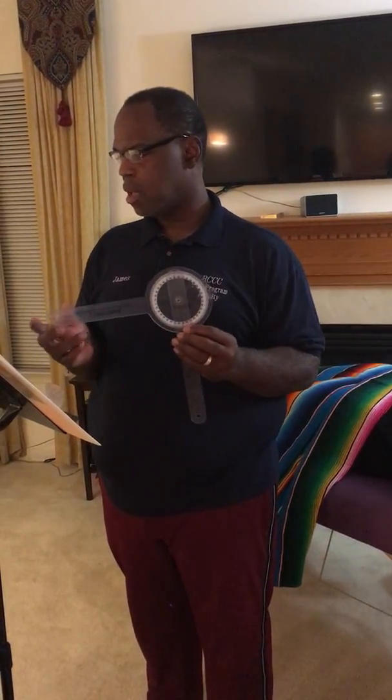All right, let's look at number 2. Reads as 0. Now, the goniometer in many positions will read as 0. Both arms of the goniometer are together, and this would be started as the neutral position for some motions as listed here: shoulder flexion, shoulder extension, abduction, forearm pronation, and supination.